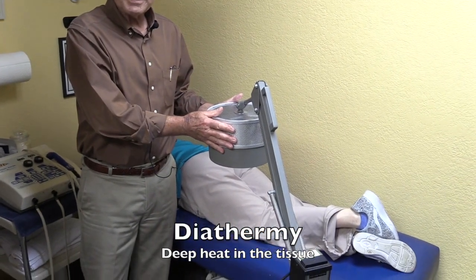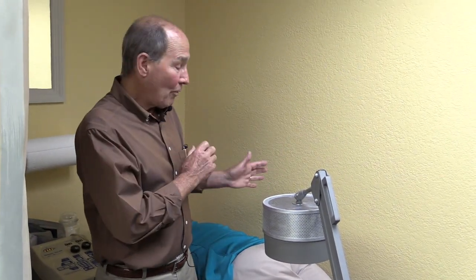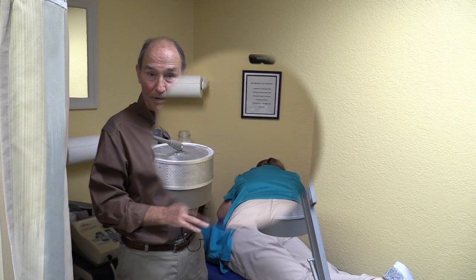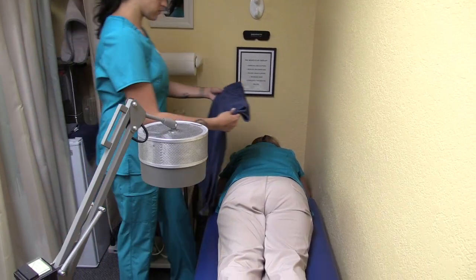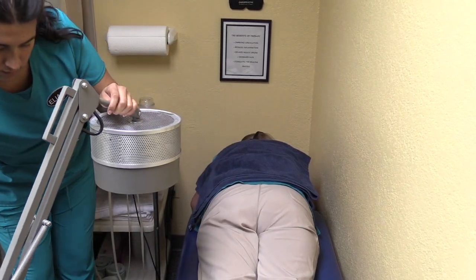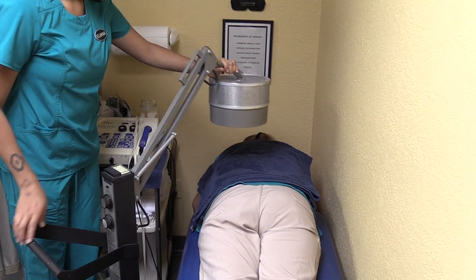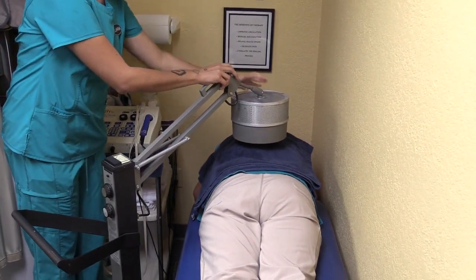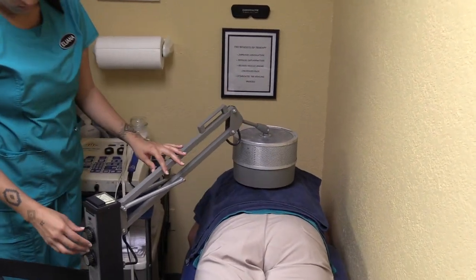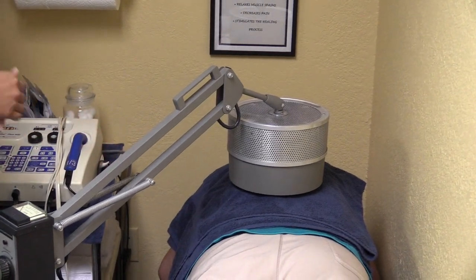It produces deep heat in the tissues, and we're just going to allow you to see how it is applied and how it would be used for someone who had need of this type of therapy. With the application of diathermy, which produces a very high frequency current that passes through the tissue, the applicator is this sort of cylindrical shaped object that you see being applied there. It goes tight up against the towel.